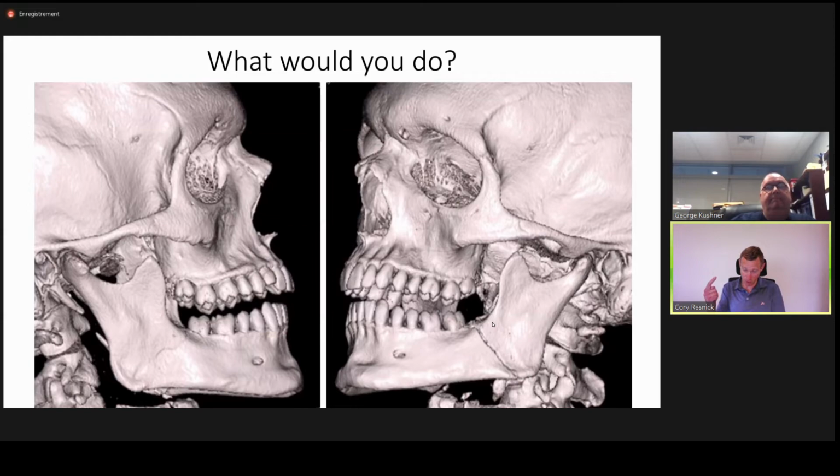You then go under the mandible in the position that you would like the wire to be inserted, and make a very small incision, typically with a blade. I think some people may do this percutaneously without an incision, but I certainly prefer to make a small incision so as to have really good soft tissue structure around that area without damaging it with that wire. So just a very small puncture incision.